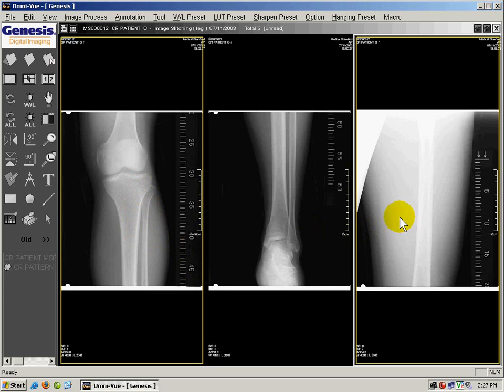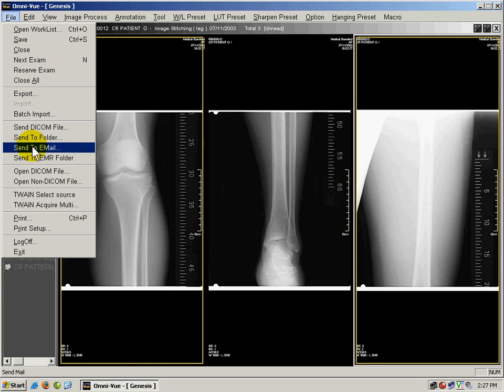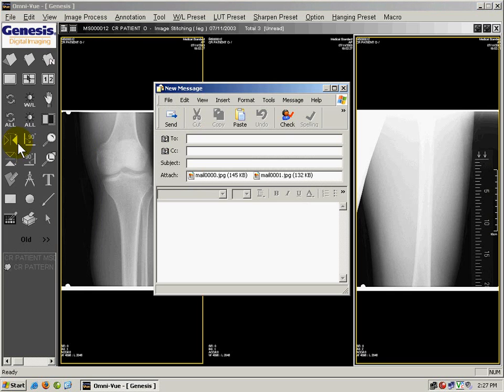When I'm done, I let go of CTRL and I click on File and Send to Email. Omniview will automatically launch Outlook Express, attaching the two images.